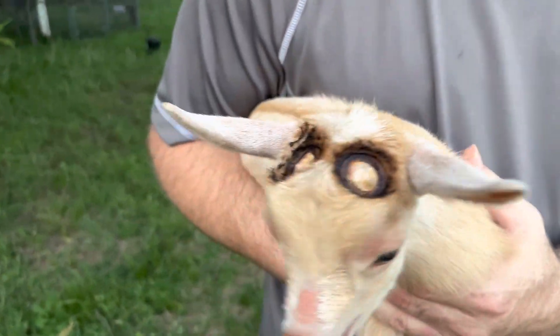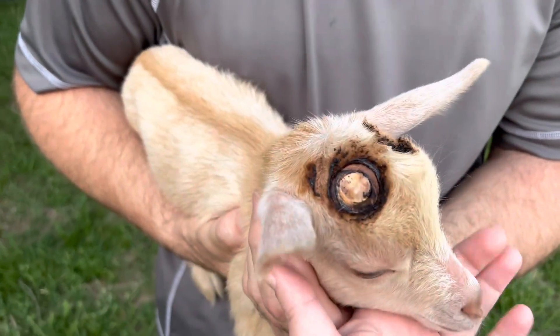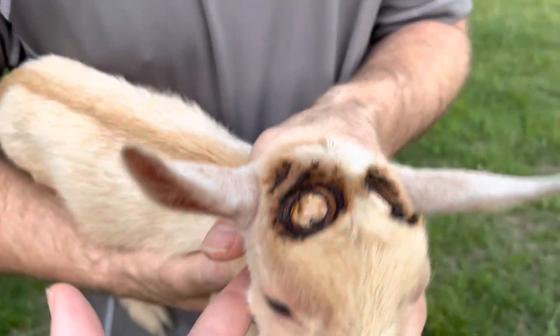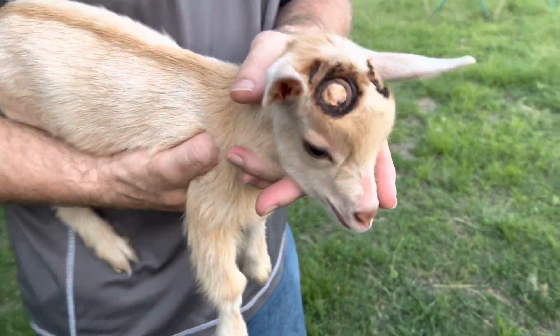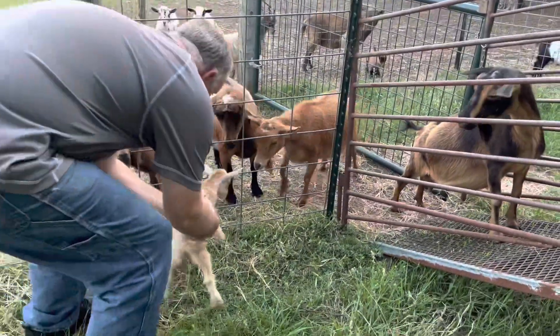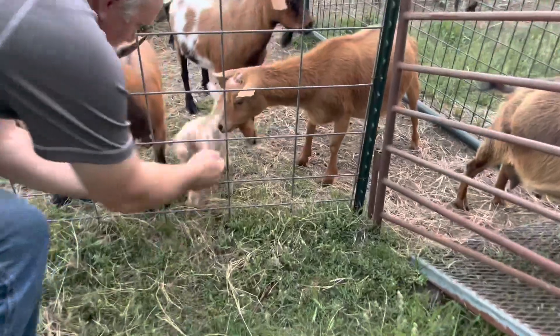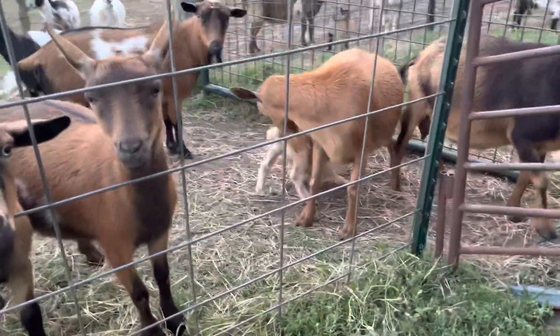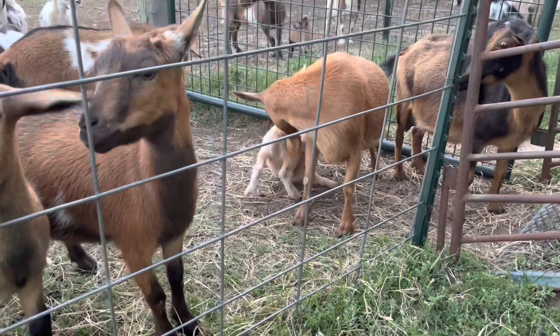You can see here she's all done. All of the blood vessels are completely cauterized — there should be no blood of any sort because you're wanting to stop the tissue growth. Now we're going to let her back out so she can forget about it and go back to Mama. Mama's right there and she already sees her. So we put the head in, let her through, and down she goes — straight to bumping Mama and wiggling the tail.